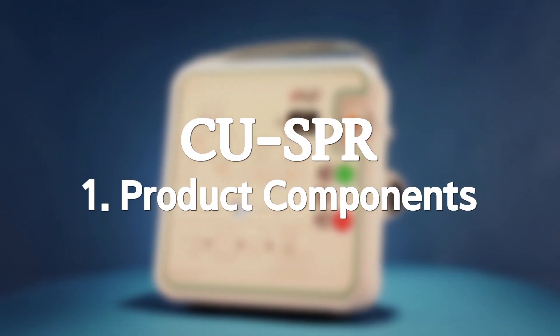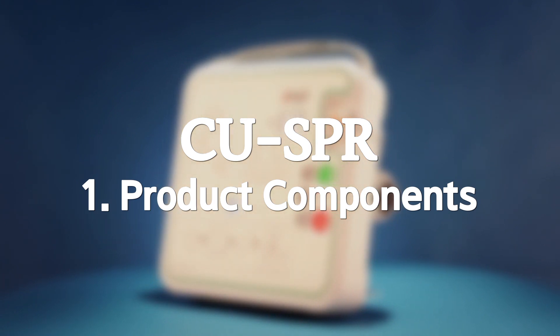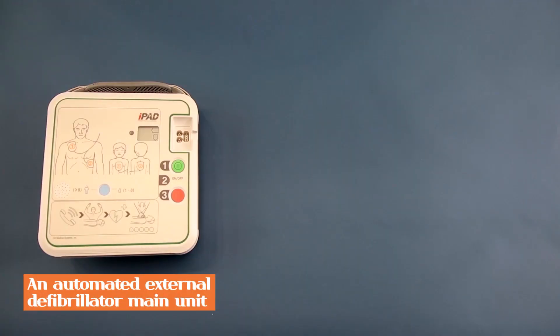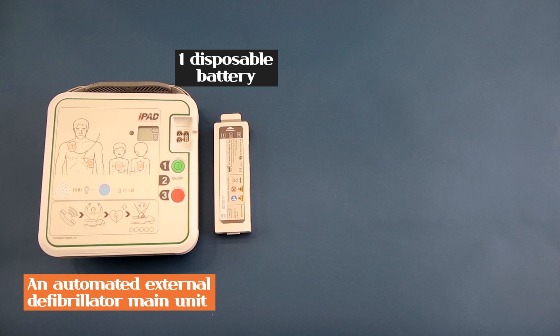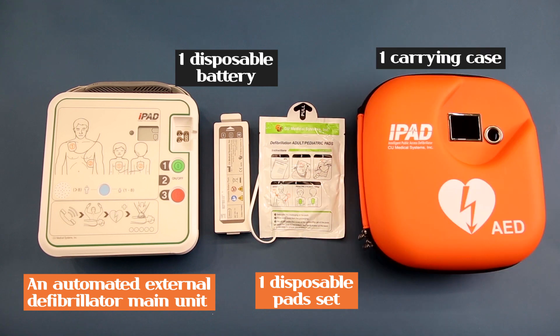The CUSPR product consists of the following items: an automated external defibrillator device, one disposable battery, one disposable pad set, and a carrying case.